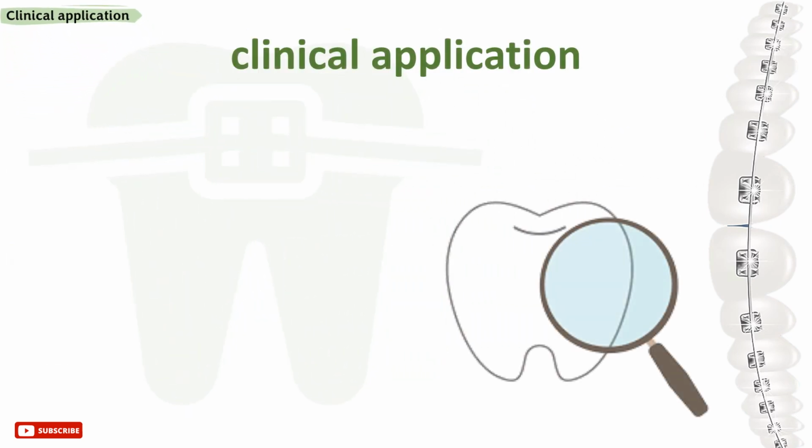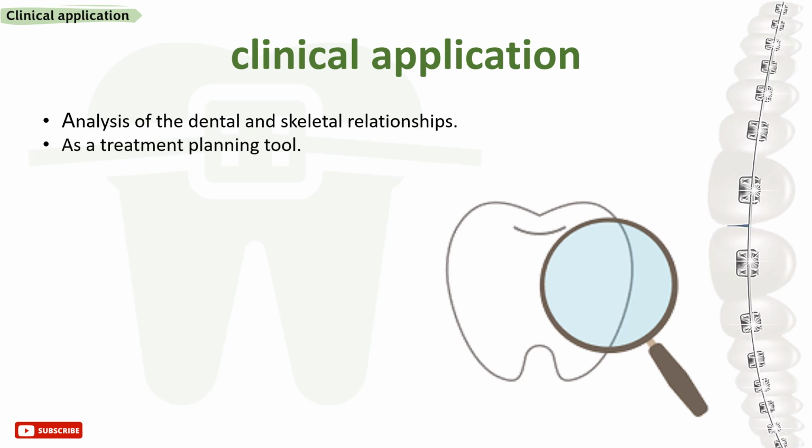General clinical applications of cephalometrics in dentistry include the following. It can be used to analyze the dental and skeletal relationships of a human skull. Also, it is frequently used by dentists, orthodontists, and oral and maxillofacial surgeons as a treatment planning tool.